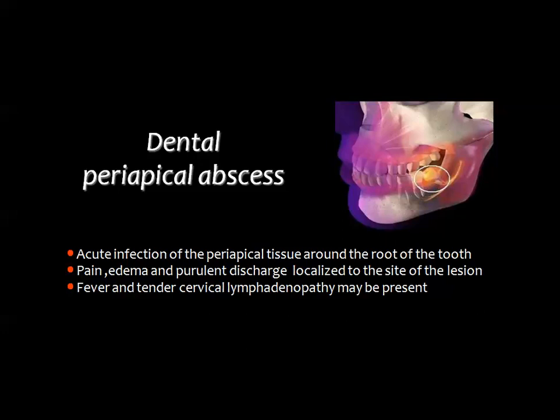Then we start with the dental infections, which of course will spread to the nearby soft tissues, including the floor of the mouth.